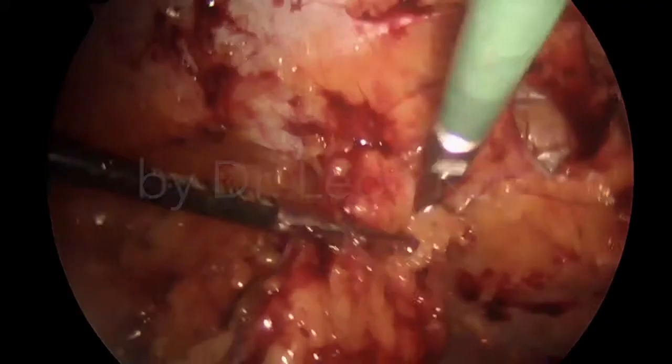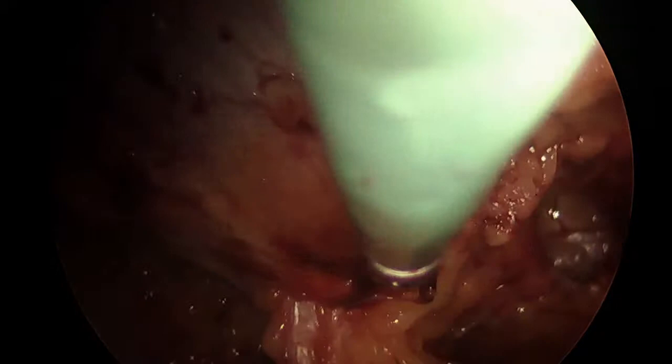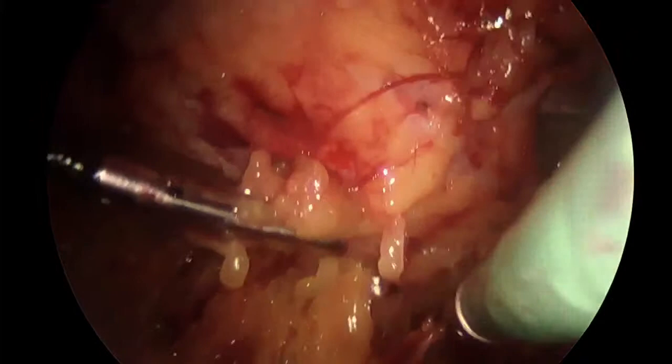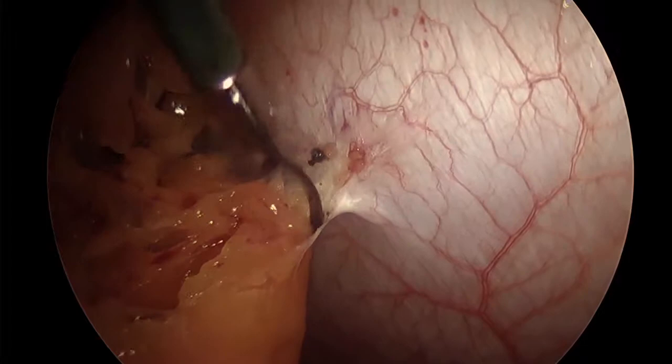In this video, we present the use of a robotic platform in order to repair an incisional hernia. The surgery begins with a laparoscopic approach. After examining the adhesions and the nature of the hernia, it was felt that most of the dissection could be performed laparoscopically, thus minimizing the necessity of using some of the more expensive robotic equipment. And the robotic equipment would then be utilized for the actual repair of the hernia.